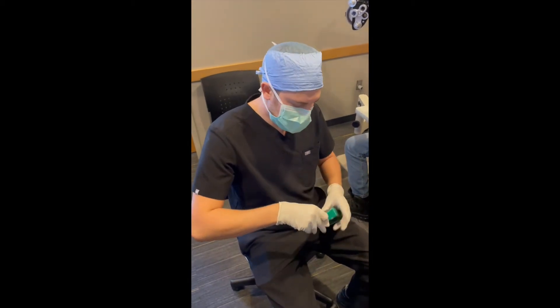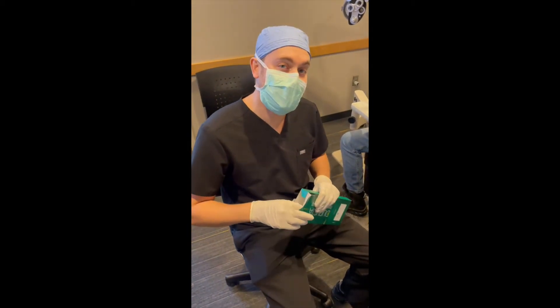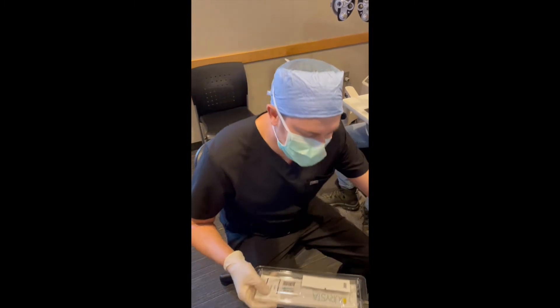Hi, I'm Dr. Brian Schaefer. I'm here at Vance Thompson Vision in Sioux Falls, South Dakota. I'm going to show you how we do Darista here.